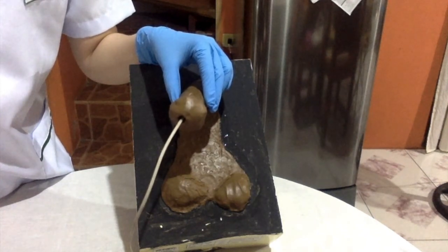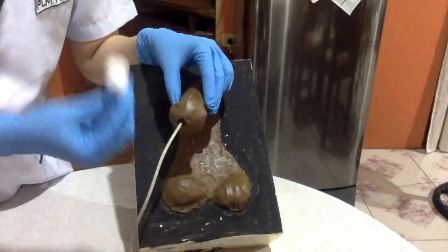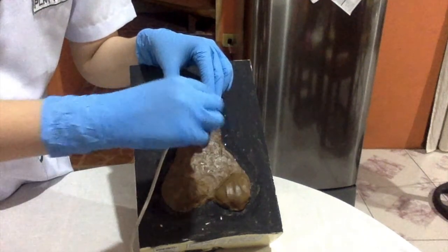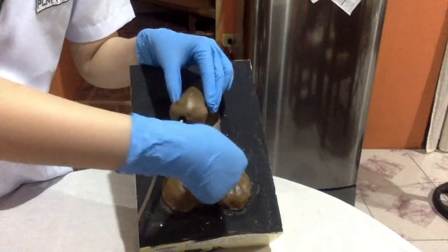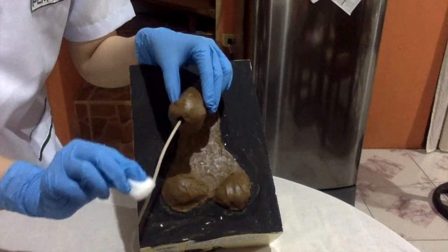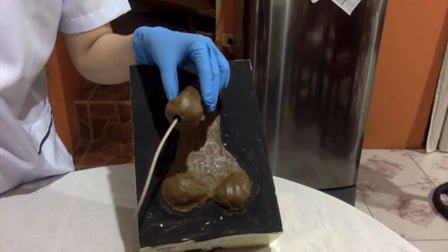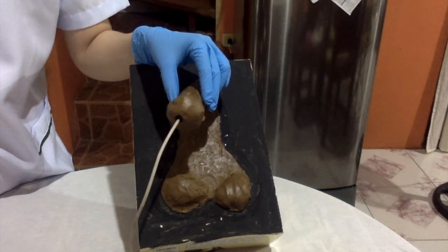Then we will rinse the area thoroughly. If ordered, we may apply bacteriostatic ointment around the catheter site. This removes potentially irritating agents and retards the growth of bacteria and infection.